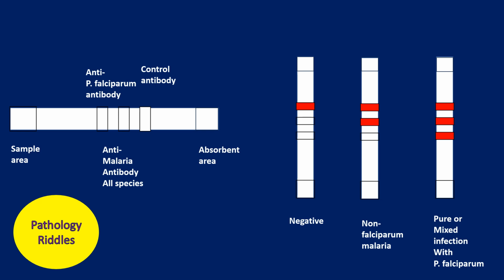The test takes about 5 to 15 minutes to complete. Depending on the test results, we can detect if it is pure falciparum infection or a mixed infection by 2 or more parasites, or negative.